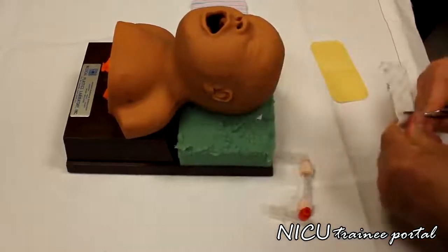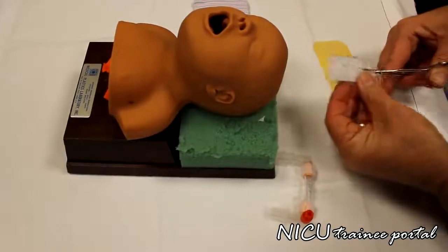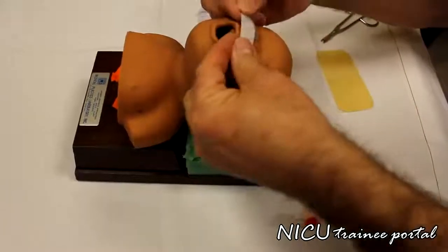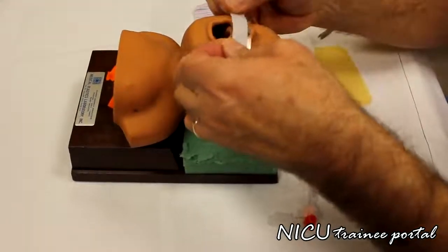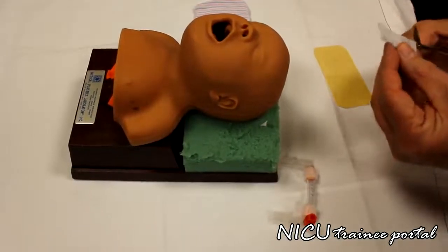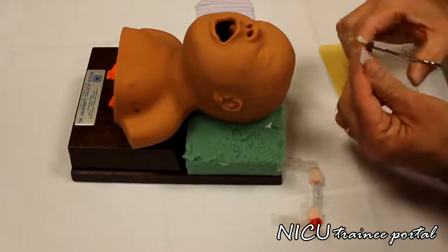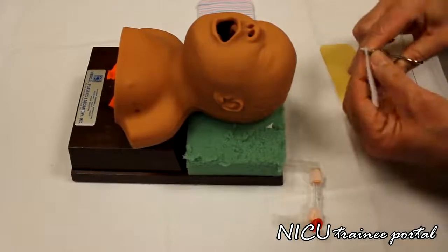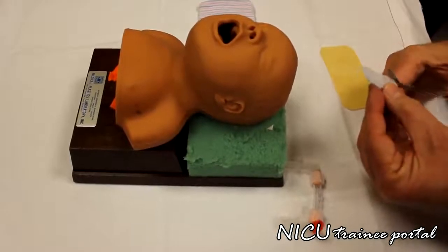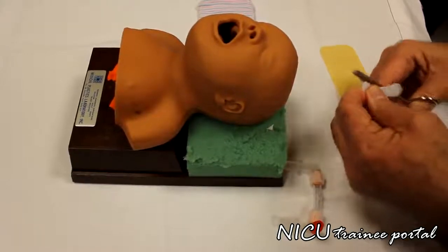Typically cut. And I usually cut about half the width of this, right down the middle. And you can see it's typically from here to here, approximately. But you can see it's a little too wide. So how I start out is I'll actually round it off on one end and the other end. And then kind of go in to where the nose would be. So we want that pretty narrow.